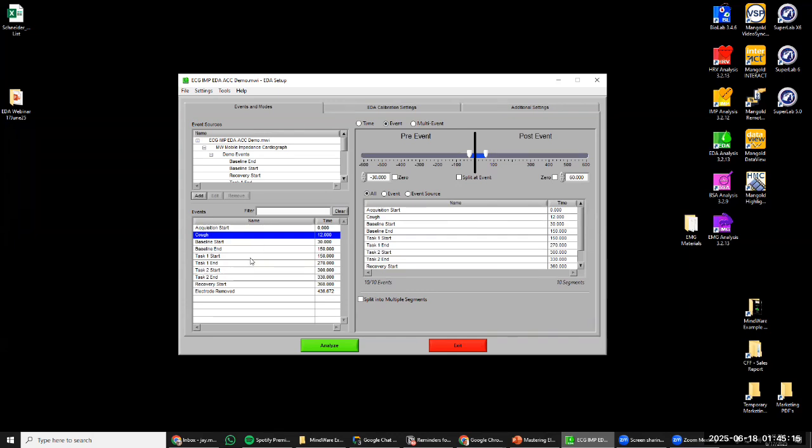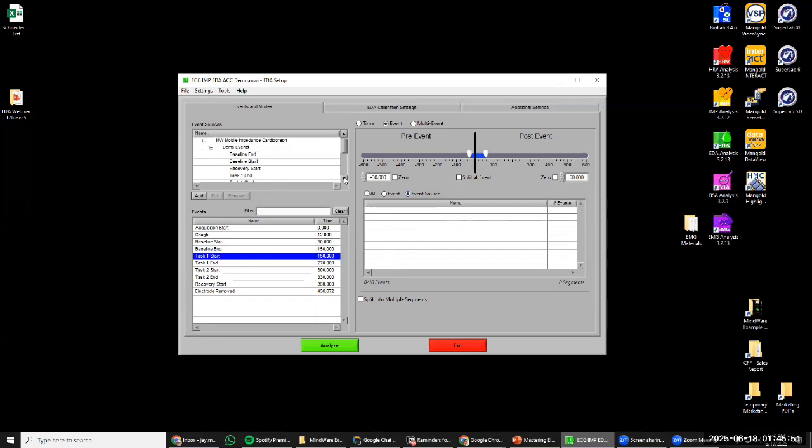And so in this case, we can see if there was some sort of physiological event that occurred around those. Usually something like a cough or a door slam, something that's not part of the protocol, is not what we normally want to pick up on. But if there was something such as the start of a task, let's say that task was a startle protocol, they're seeing some sort of shocking image, or we're acoustically startling them, we could take it over here and say, show me the beginning of this task. I'm going to go from event source.